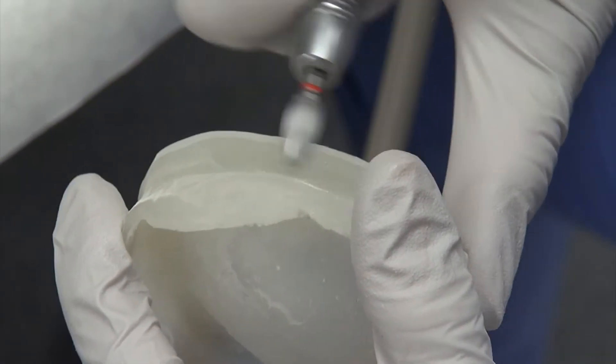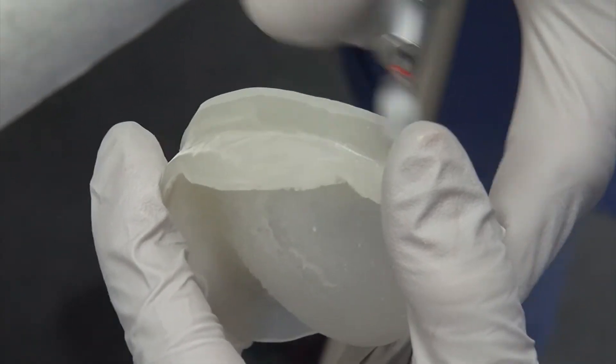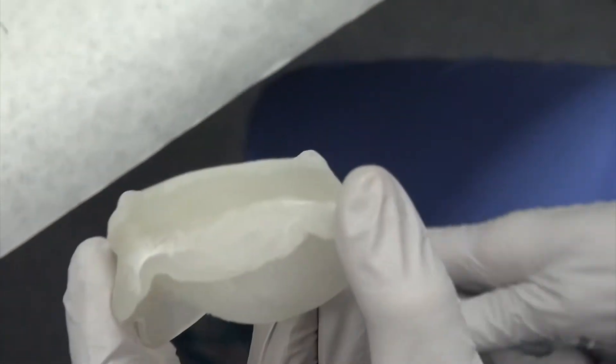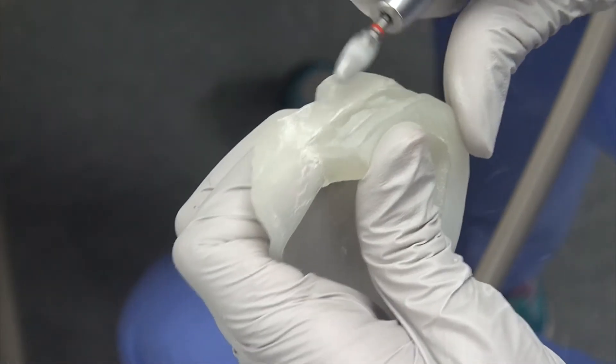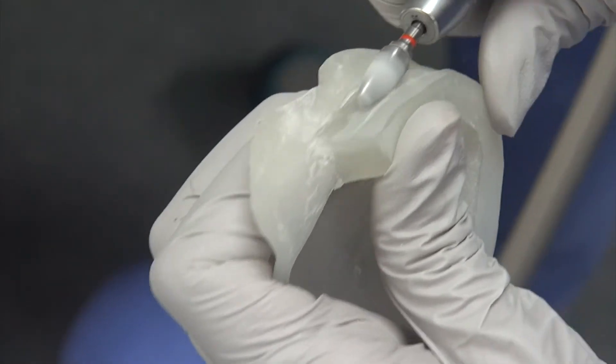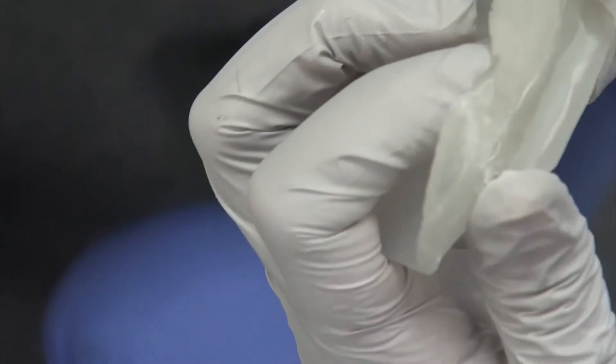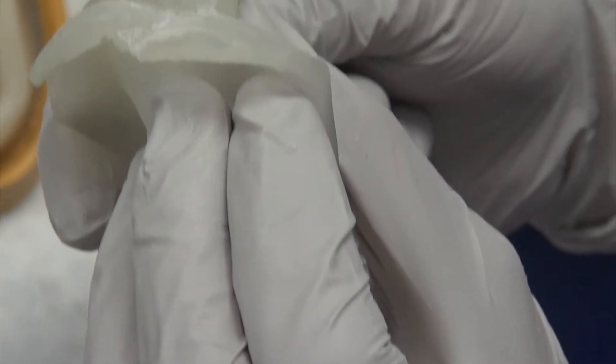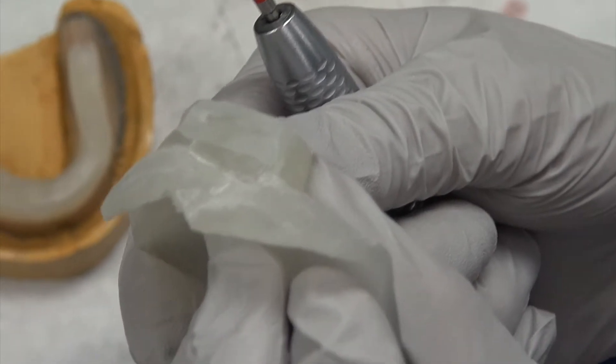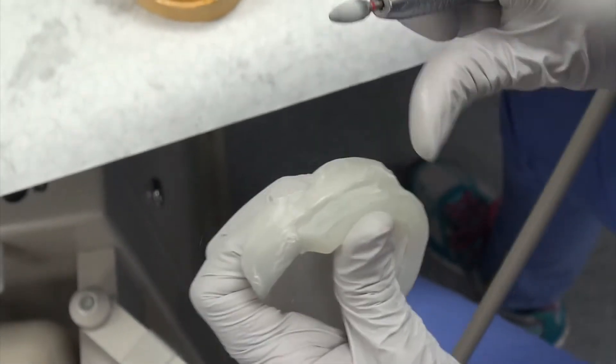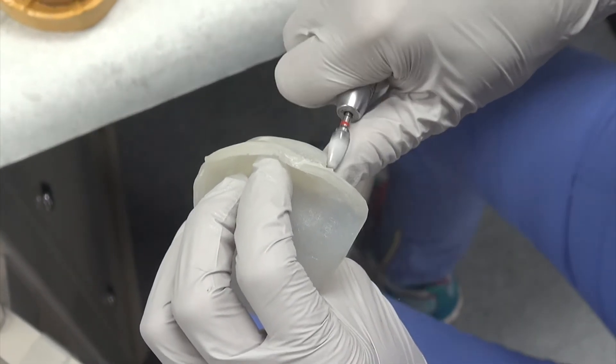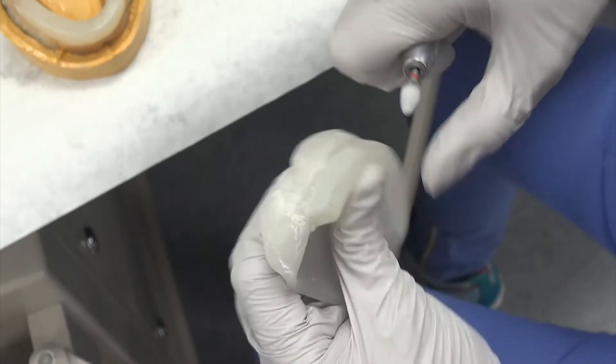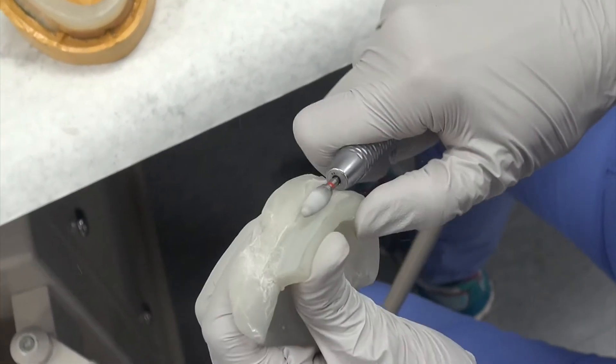Now, the thing you want to be really careful of is that in doing this trimming, you haven't gotten rid of your little concavity. If you have, or if you didn't put it there to begin with, one way to incorporate it is just to glide along. And can you see how I have incorporated a small concavity? So just sliding it.